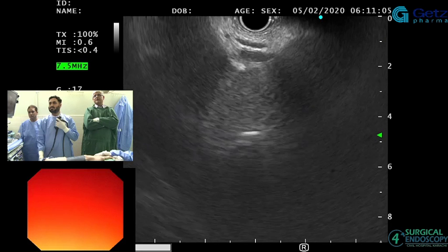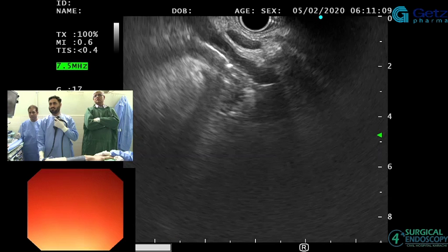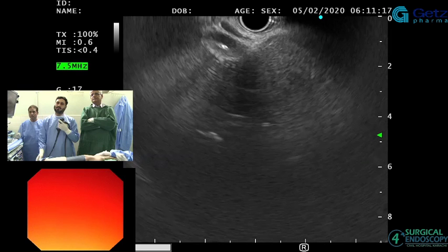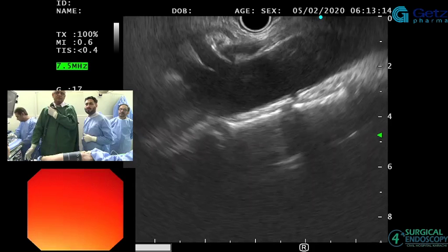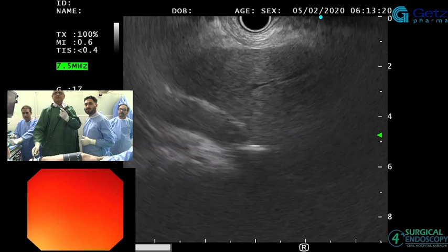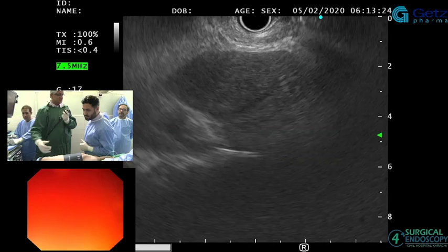CBD or no pancreatic mass, CA199 normal, so we are doing this to find out why she's got distal CBD stricture, okay? So what are you trying to find out? No. You've got liver. So now if I go back here, that's your liver, okay? Right? We are at about 40 centimeters, so 5 centimeters into the stomach.